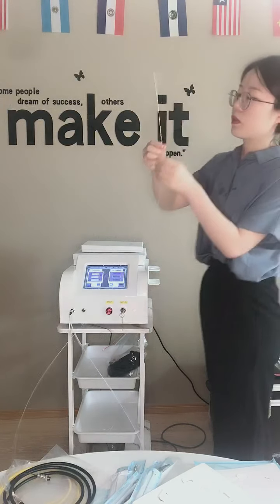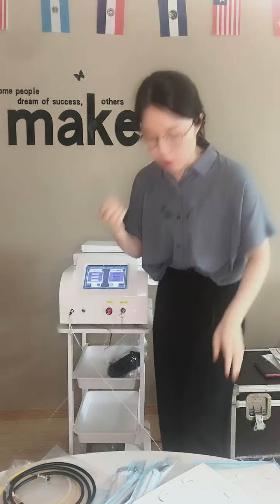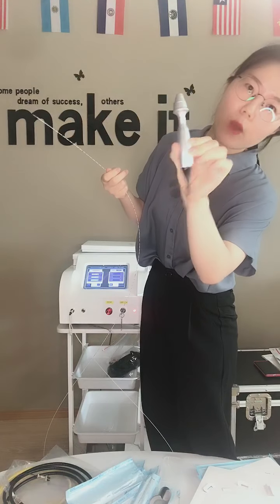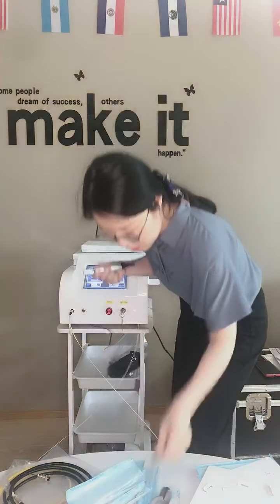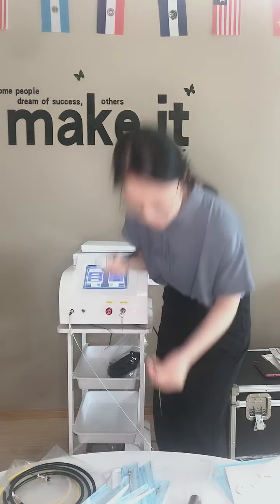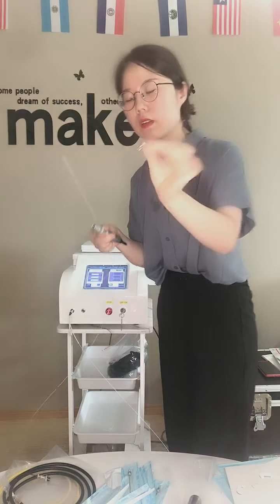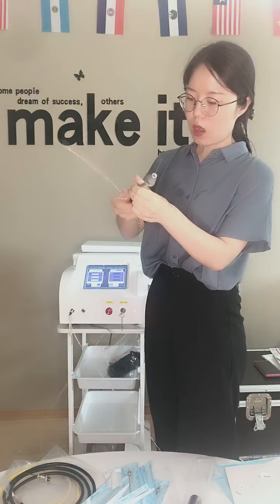And this is the radial fiber, as you can see here, it has the scale of the fiber. When you're doing the hemorrhoids, it's very helpful. We will install this to the hemorrhoids centerpiece. You can see here, it's the white one, very professional. Sorry, just now I was using the wrong needle. This is for hemorrhoids. It's not for the lipolysis, it's a different method for the face. So now I will install this one and show you how it's working.